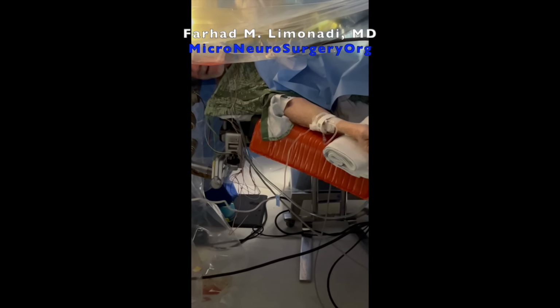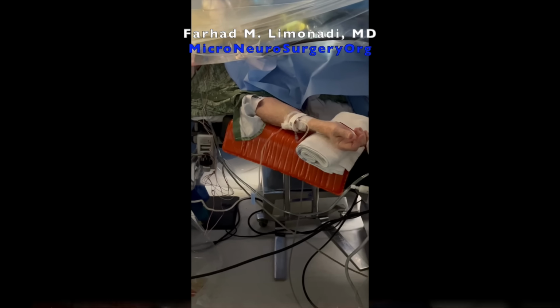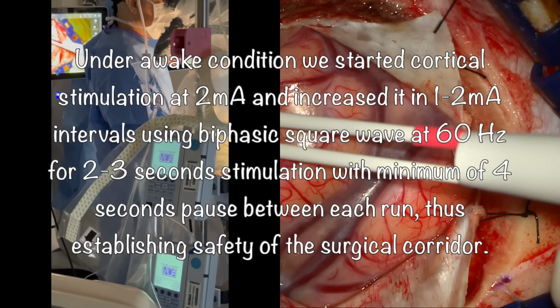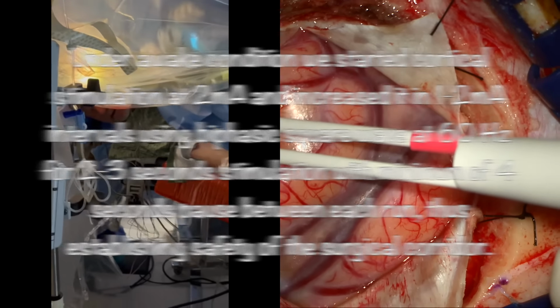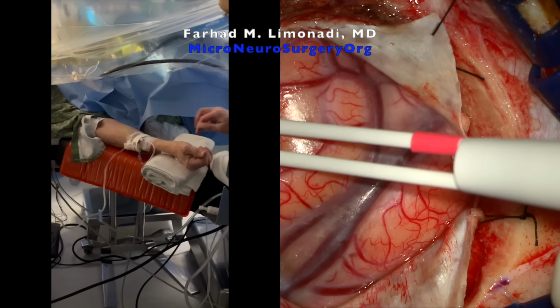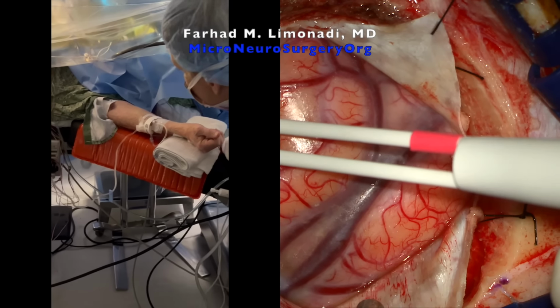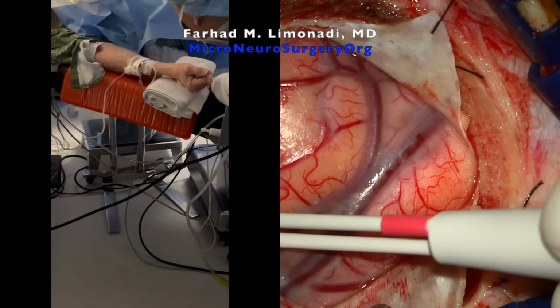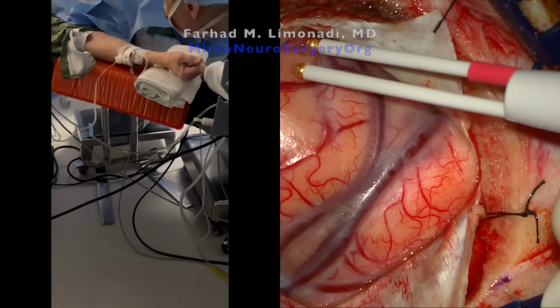Hello. Good. Everything's good. Under awake condition, we started cortical stimulation at 2 milliamp and increased it in 1 to 2 milliamp intervals using biphasic square wave at 60 Hz for 2 to 3 seconds stimulation with minimum of 4 seconds pause between each run, thus establishing safety of the surgical corridor.